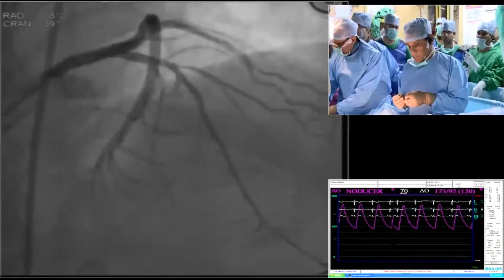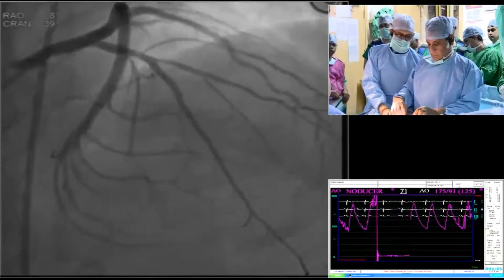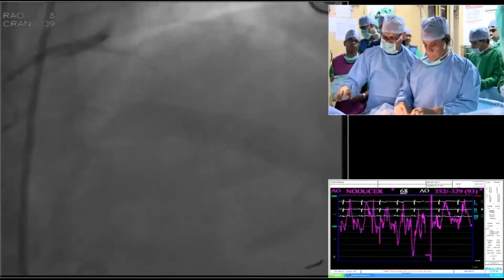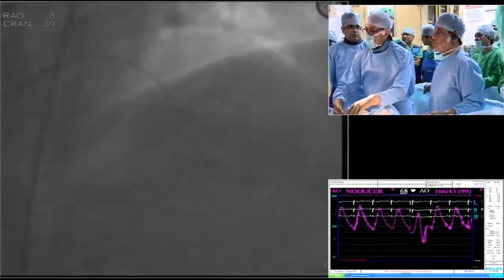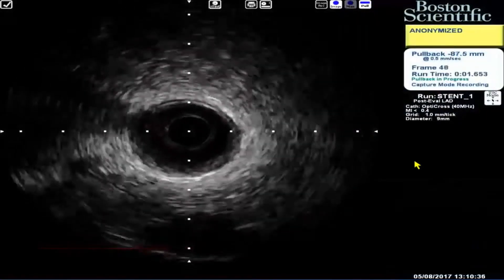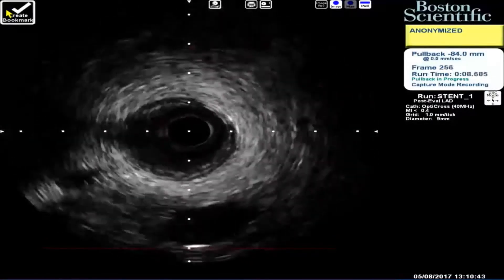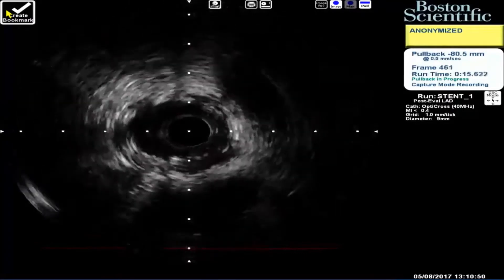3.5 could be a bit large for a 2.75 scaffold. Good. Now we will enter into the scaffold with the IVUS.